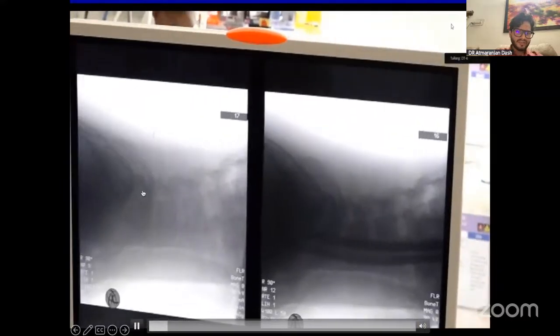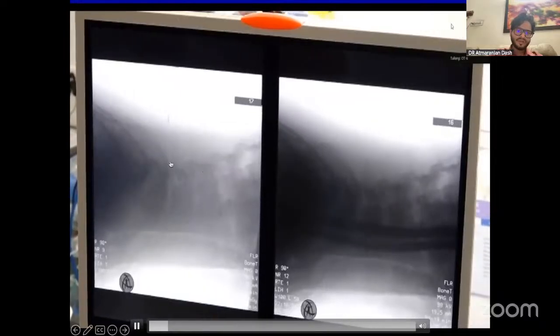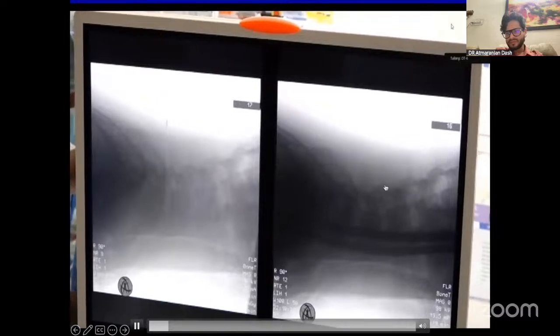So you can see this is a Namaste at every level. This is the highest point of the facets in the lateral view, which we call the Namaste point. So you can very well see this Namaste at every level. So this is the level we mark.